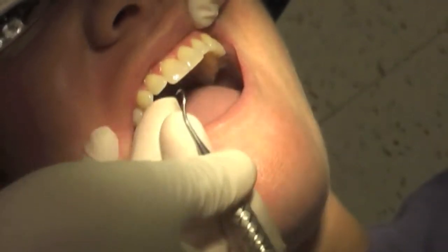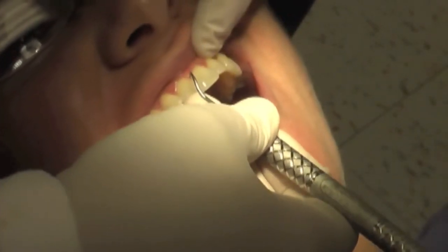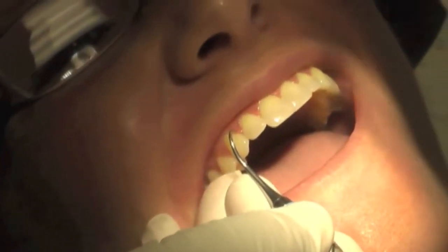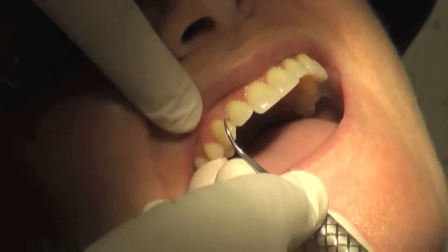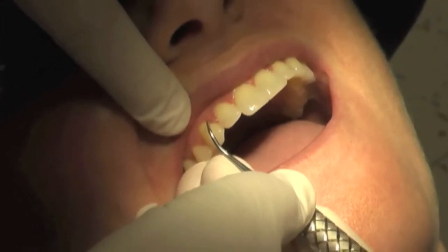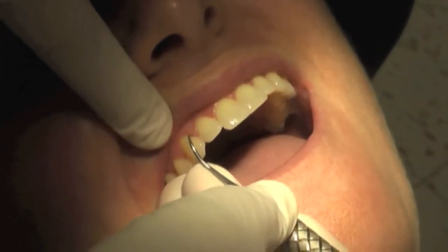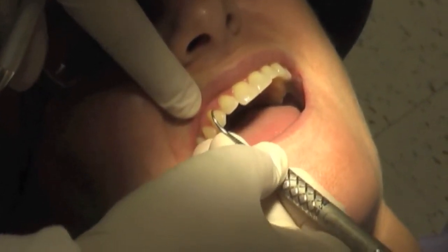We can even hear — even though Marcy doesn't have anything — you can hear my blade kind of digging. When I go in to see if there's a piece of deposit, I go in with such a light stroke that you could take the instrument out of my hand. So you can go in leading with the toe and just feel for something. Once you get a piece of deposit identified, go ahead and apply — now you can see my grip become stronger, I apply lateral pressure, and then actually go in for a working stroke. There's a difference — see the difference in my hand versus this.